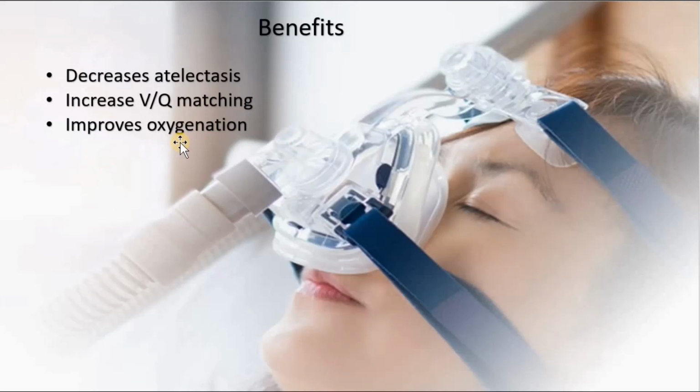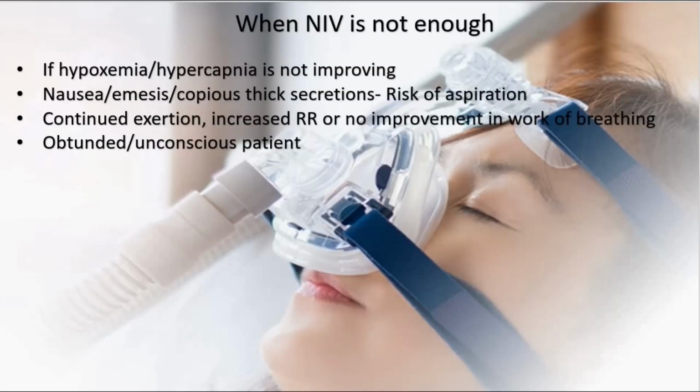Now at last, you should know, when a patient is placed on positive airway therapy, what are the key points you have to monitor, or that show the non-invasive ventilation is not enough and you may have to consider invasive ventilation. So what are the points? If hypoxemia, that means decreased oxygen, or hypercapnia, or increased carbon dioxide, is not improving. It still remains the same. The patient has low oxygen or high carbon dioxide. If it is not improving with CPAP or BiPAP, consider invasive ventilation.